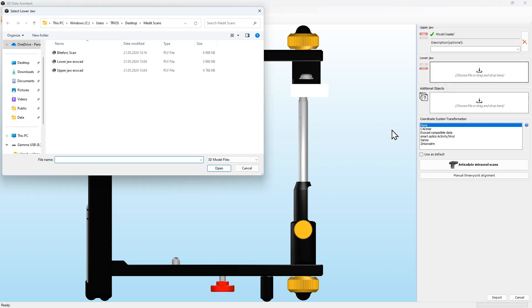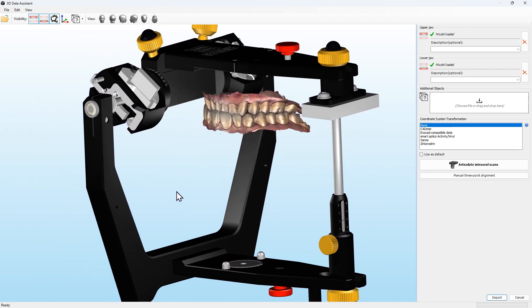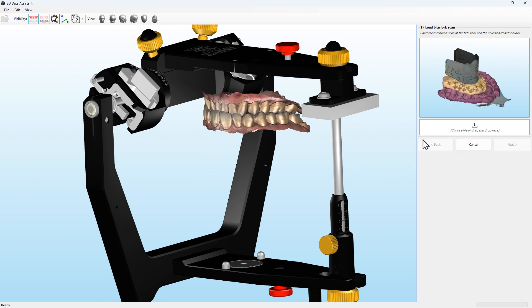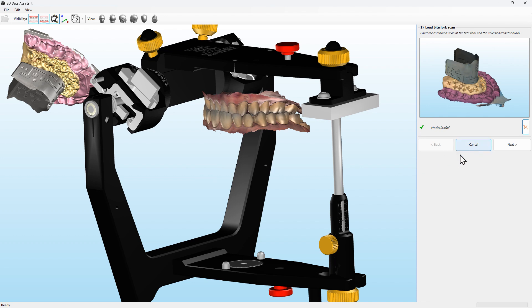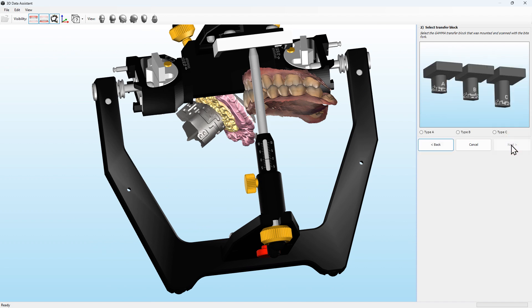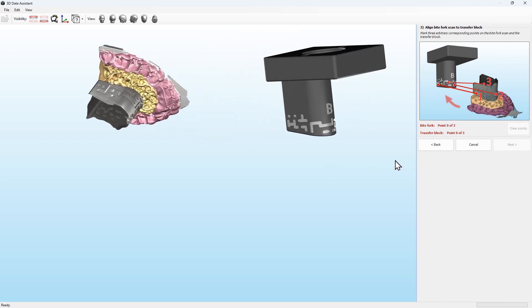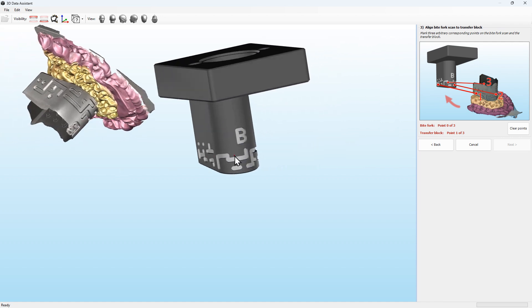When importing these files in Cadius 3D, the software provides you with a step-by-step assistant for articulating the intraoral scans. Select the right type of digital transfer block, then follow the step-by-step assistant of the software and align the bite fork scan to the transfer block.